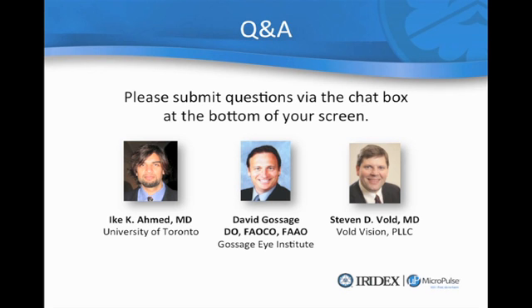So from my standpoint, I have a tendency, I think, now to move towards MicroPulse laser trabeculoplasty, just because we know we're not doing any harm. If you look at some of those earlier cadaver slides from Noecker, you didn't see any thermal destruction at all of the trabecular meshwork on those cadaver slides. So I feel very comfortable going ahead and attempting a MicroPulse laser trabeculoplasty first. And I think the patients appreciate that too, just because they know that they're being treated, they feel comfortable.